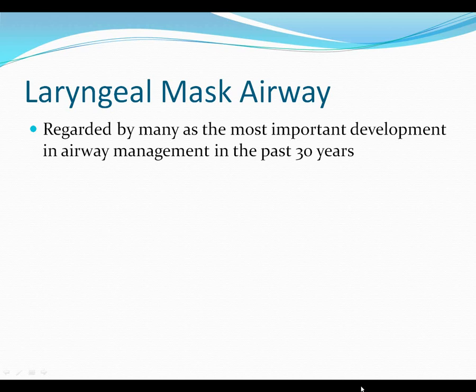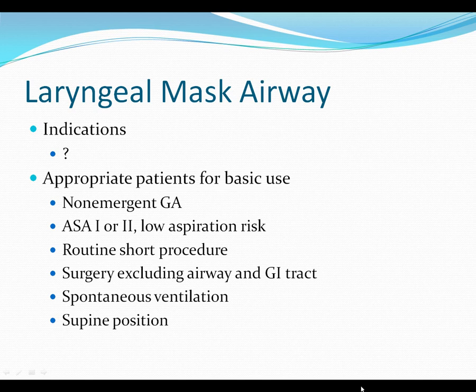All right, LMA. Everyone's been using this, I presume. It's regarded by many as the most important development in airway management in the past however many years you want to say, 30 years. Does anyone know any rock-solid indications for an LMA? I couldn't think of any absolute indications for LMA. But we use it a lot, and I would say, at least in the beginning, I would call it basic use of the LMA.